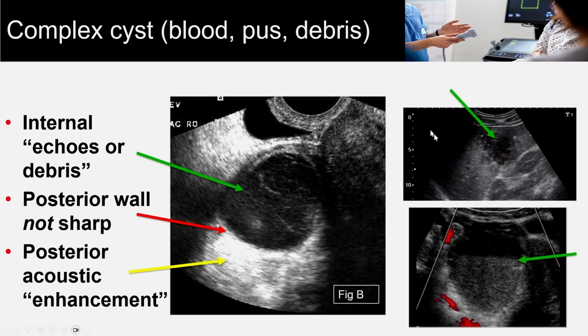This is a liver abscess where we see multiple echogenic nodules and irregularity of the wall along its side. You can see internal echoes. It is hypoechoic. It's not really anechoic anymore.